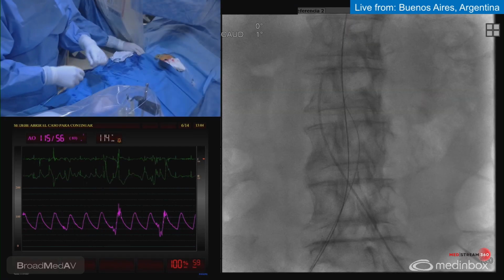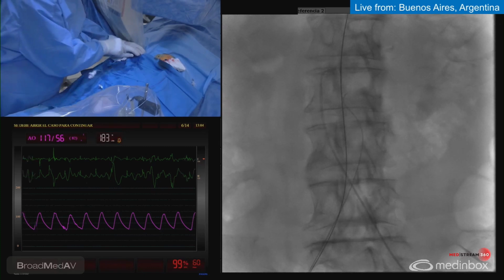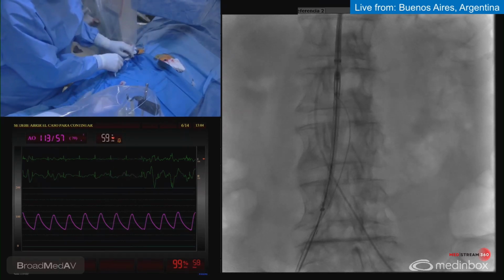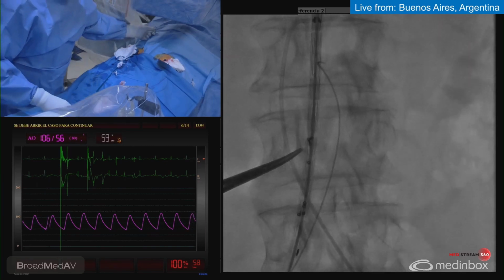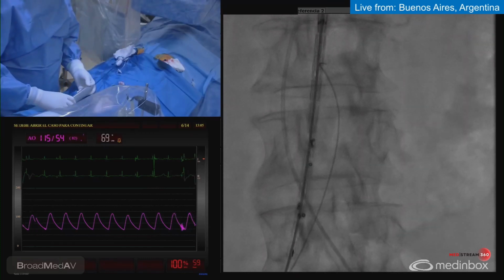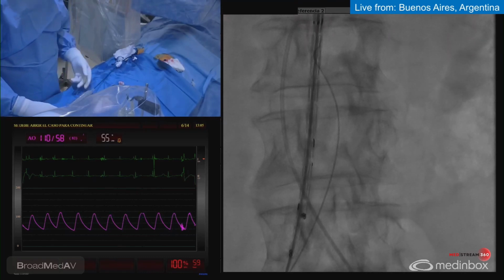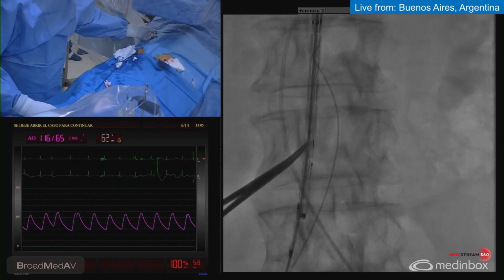branch. So here we have two anatomical challenges. One is the proximal neck, calcified, a little bit tapered. You can observe how easily the device is advancing. We might zoom now on the device, and we focus on the markers. So here we have like an R configuration. This is the orientation of the contralateral stump in posterior. If you rotate here like a 7, it's going to be anterior. If we put here like a capital E, it's going to be on the lateral side of the delivery. So you can observe here this capital E.